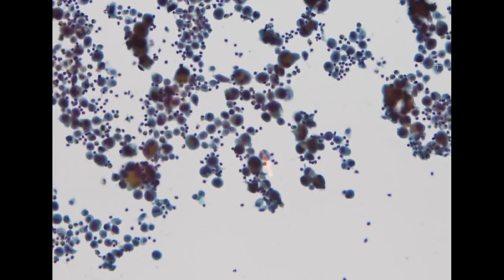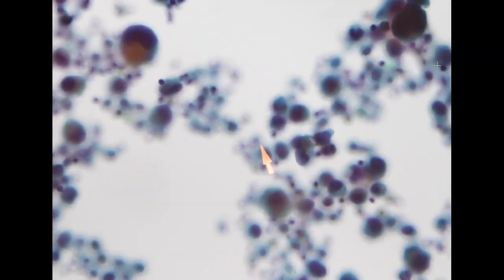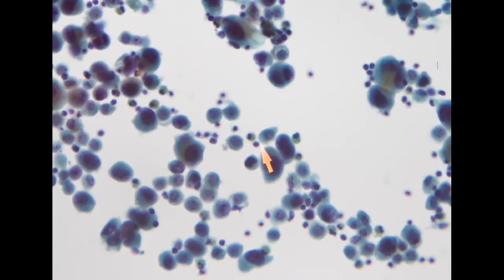So the next specimen is also lung cancer with a similar presentation. It is a different patient, so it is very common that we encounter this type of specimen in our practice.